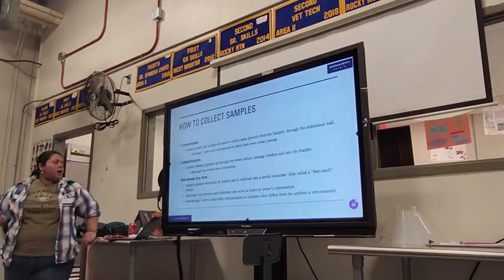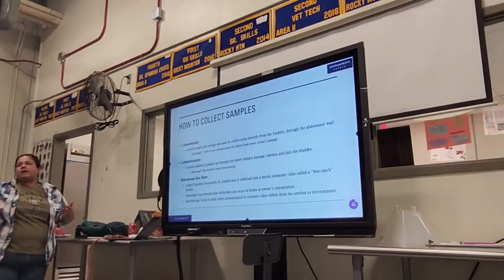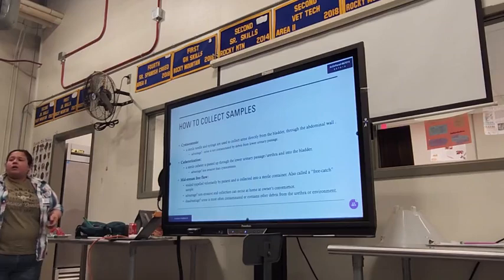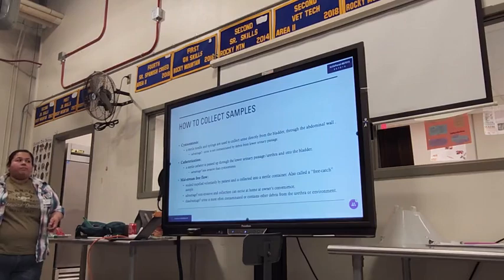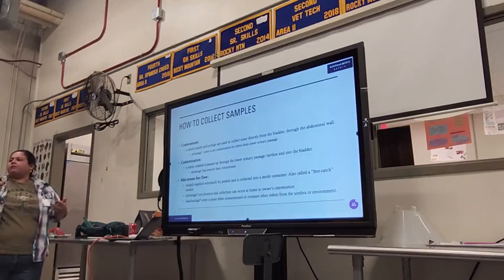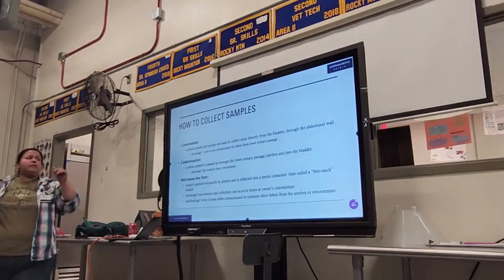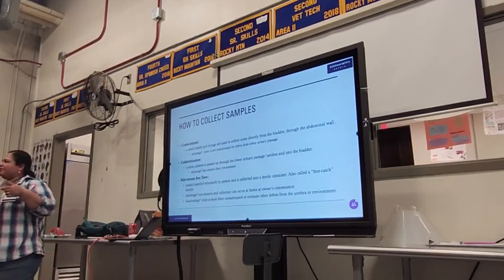Okay. So really quick, how to collect samples. There are 3 methods. Well, technically there are 4, but the 4th one I decided to log off of. Cystocentesis. You take a sterile needle and syringe and you poke through the abdomen into the bladder. This will actually cause bleeding, right? You're not just getting the urine, you're also getting blood because you caused the piercing. Now, the advantage to cystocentesis is that the urine isn't contaminated. It's coming directly from the bladder into our sterile syringe, right?